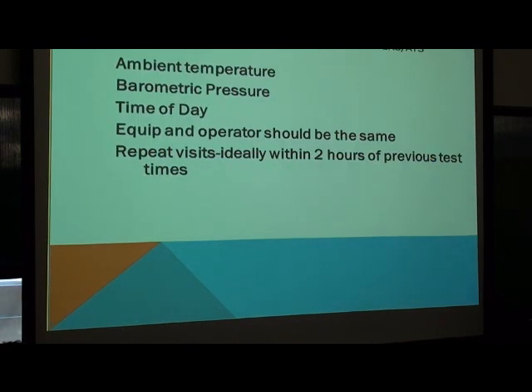So then we get into what you folks do as far as testing. Collecting of ambient temperature and barometric pressure, that's the start of the day. We go around saying, hey, what are the atmospheric conditions?